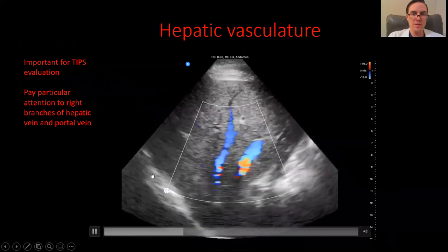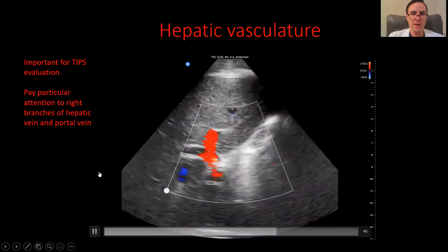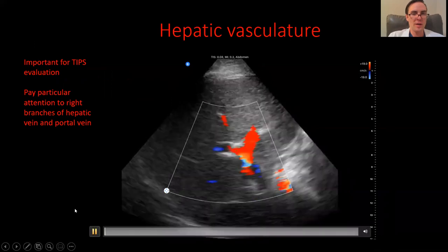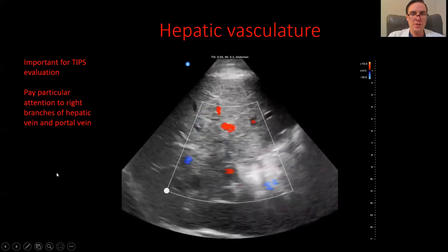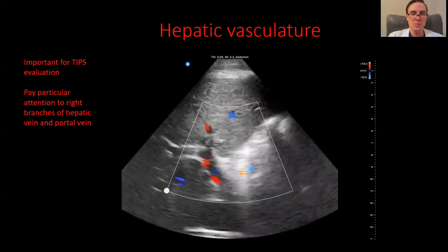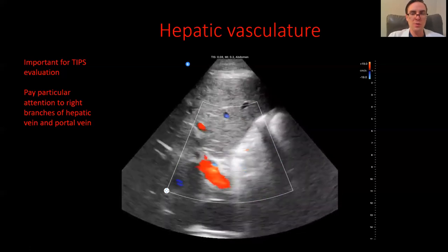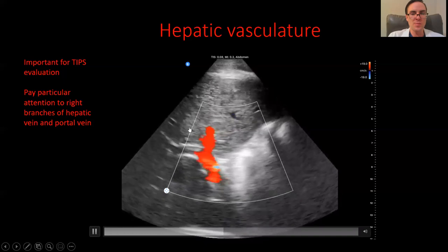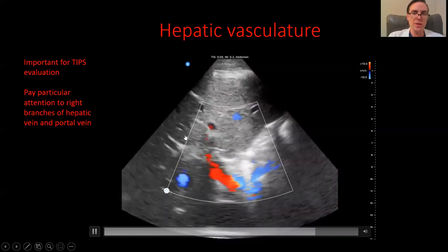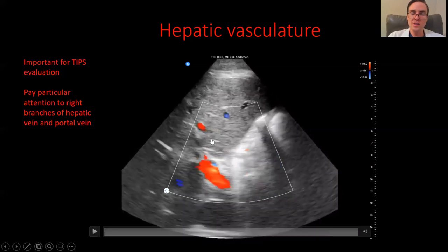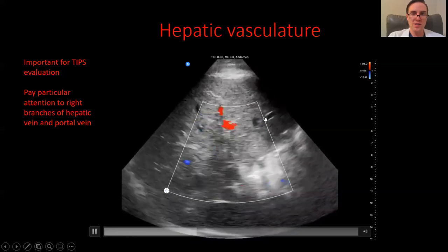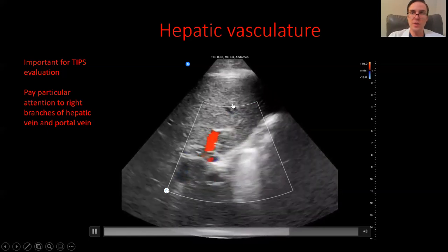Let's put it all together so we can tell them apart. There's the portal vein right there, hepatic veins right there, and hepatic artery right there — you're able to see them all and compare them. The reason you need to identify the hepatic vasculature and take proper measurements is particularly important for interventional radiology procedures. For example, if you're planning a TIPS procedure, you're creating a small shunt between the hepatic vein and the portal vein, so it's really important to know where the branches are, make sure there are no cysts in the path, and avoid causing a hemorrhage. You need to know how close the branches are to each other and what the architecture around them looks like.